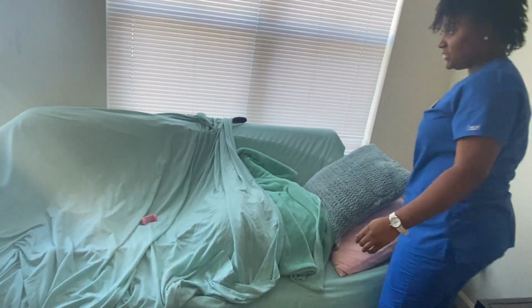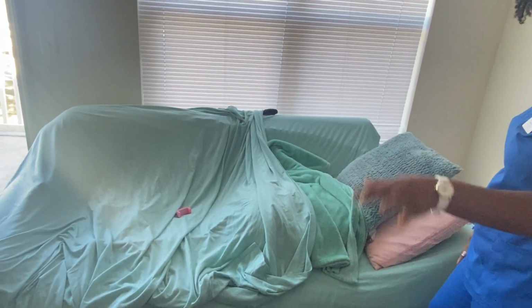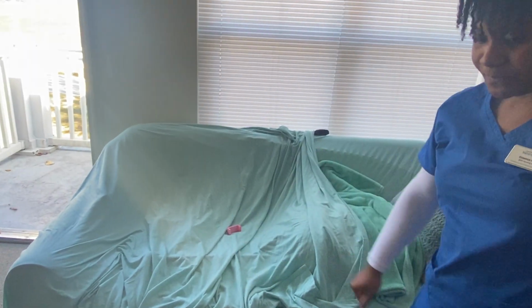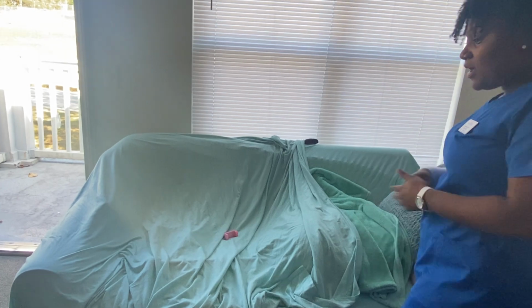Alright, but first I want to look at your surrounding environment. I want to make sure that your bed is locked, it is at the lowest position, and that your area is clutter free. Your call light is present here, I see, and your bedside table is here and your 3 side rails are up.